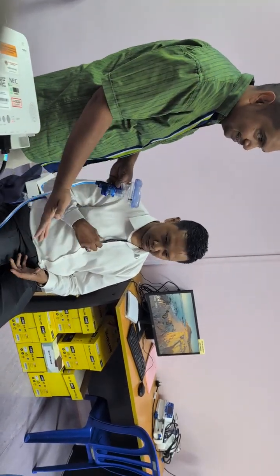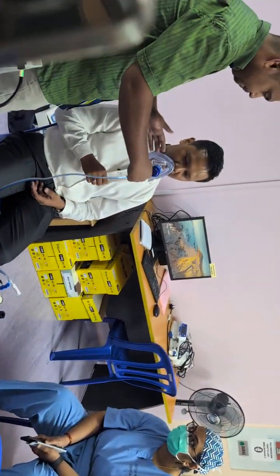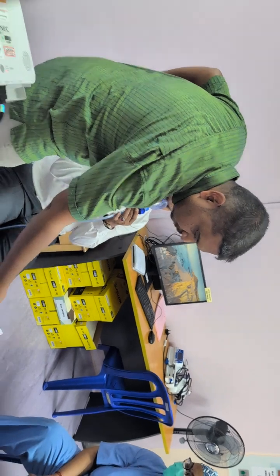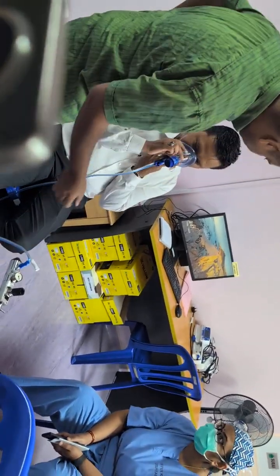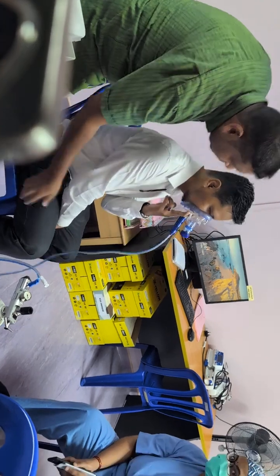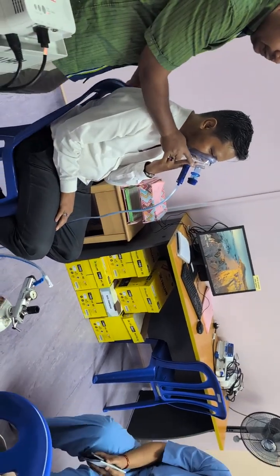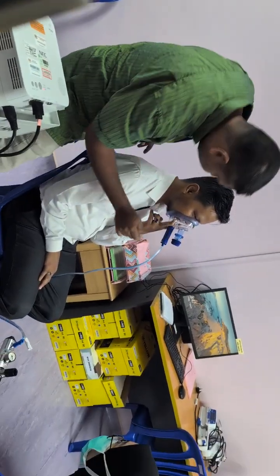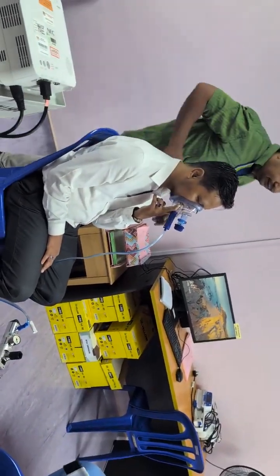This is a mask. So before we put on any patient, oxygen has to be running. Okay. Put it on, hold it tight. Okay. Turn this side. See over there? He's breathing here. Okay? Dia ada 8 ni sekarang. Saya tak pakai selimut water, okay? 6, okay.